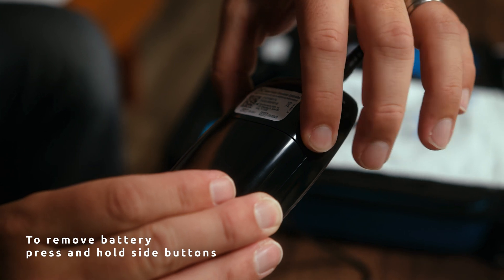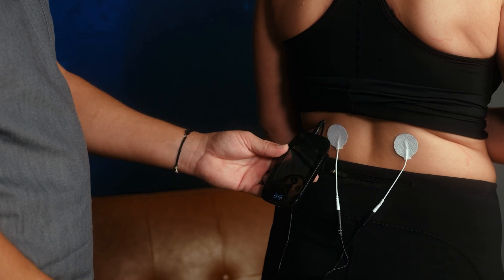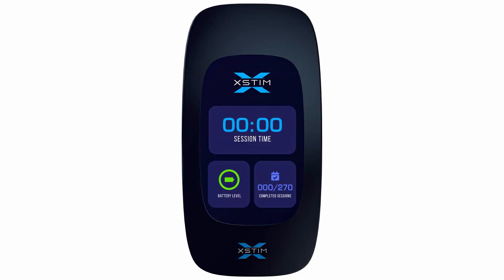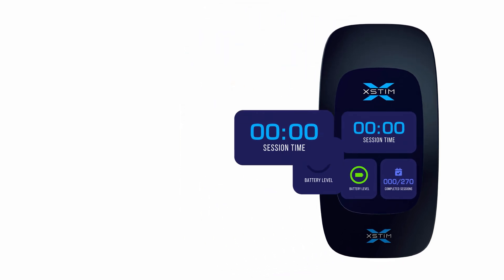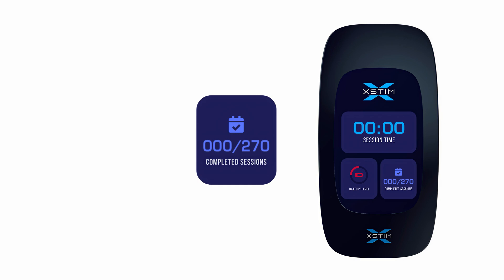Keep watching to learn about on-screen notifications and troubleshooting tips to ensure smooth and uninterrupted treatment. The X-Stim device has several notification indicators to help you monitor its status. Under normal operation, X-Stim will display the following information on the home screen: a battery indicator showing remaining battery life, session time displaying the length of time the device has been active, and completed sessions showing the number of completed 24-hour sessions.